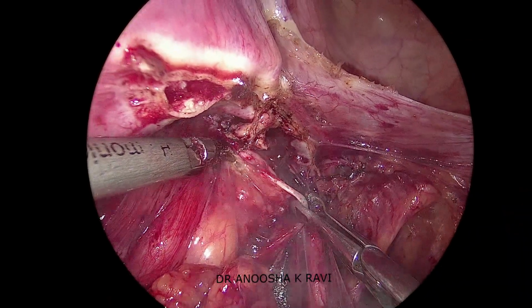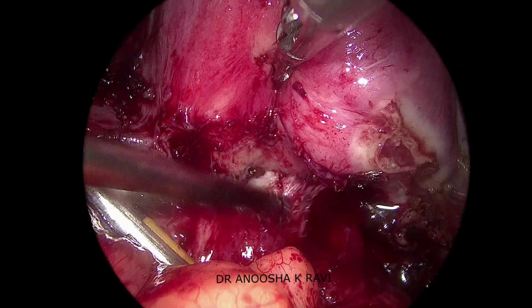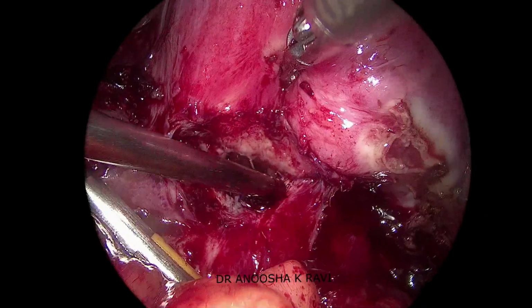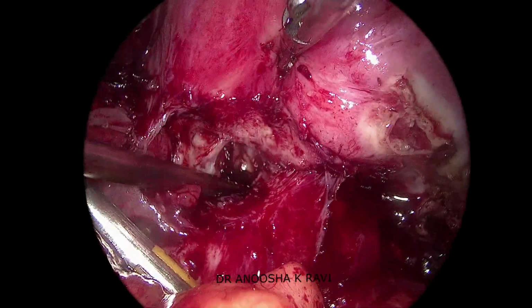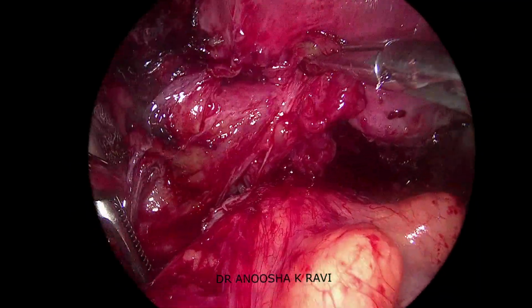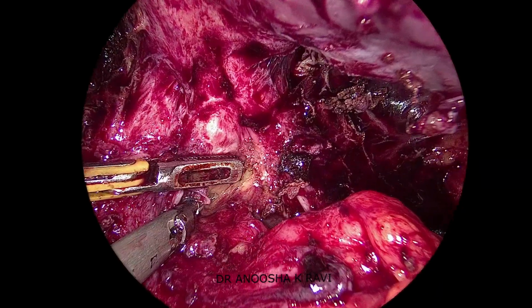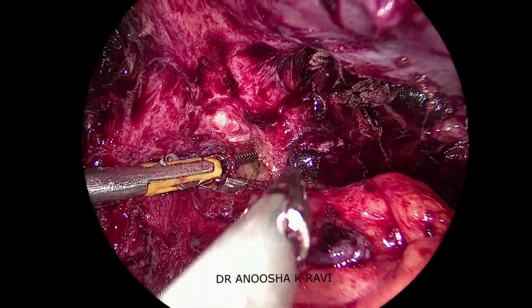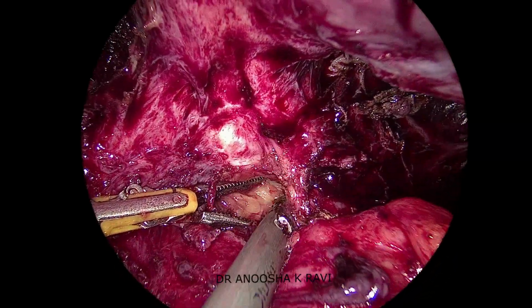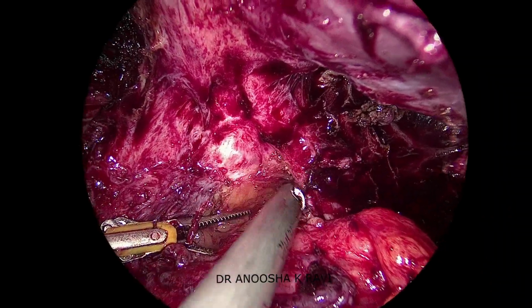This cut is advanced up until the pouch of Douglas. With some blunt dissection, a pocket of chocolate fluid is noted in POD. Similar dissection steps are carried out on the left side. After pushing the rectal fat medially and the right space is identified, right uterosacral ligament can be coagulated and cut.